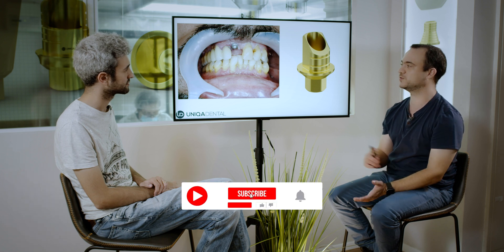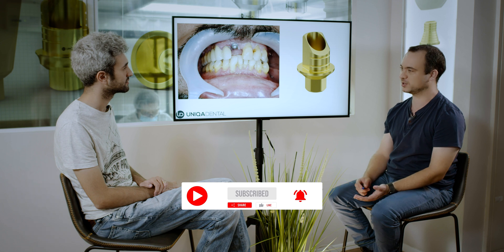Today we're going to show a case where we want to make a restoration on a single frontal tooth. In these cases, if we want to make the restoration from zirconia, the only part we can use is the T-bases. Today we're going to show different types of parts and where each type can be used. In this case we used a T-base with an angulated top because the implant is buccally inclined and the screw channel will come right in the middle of the tooth. If you don't change the angulation of the screw channel, it would come out right in the middle of the tooth.